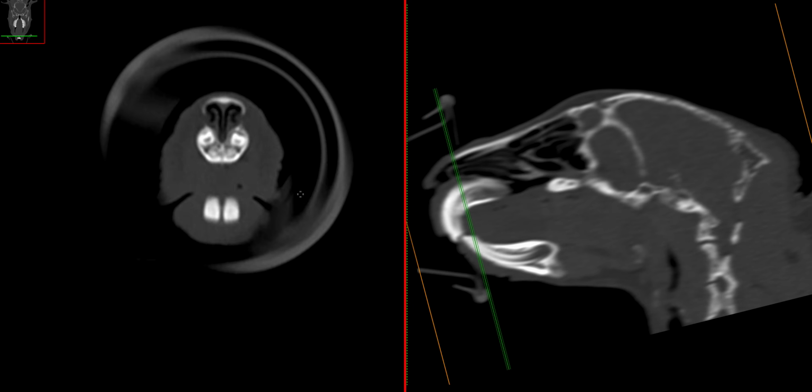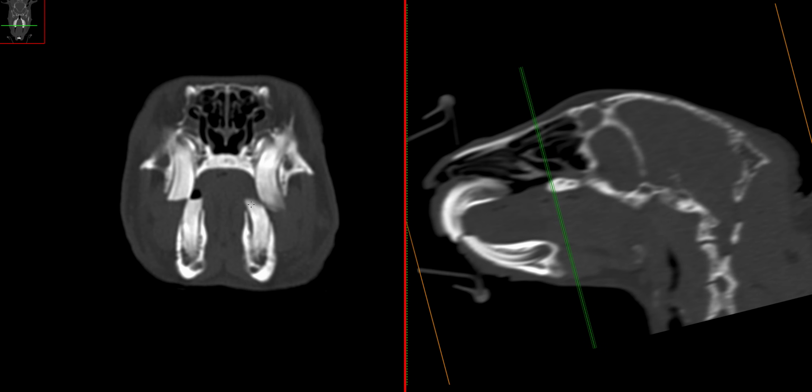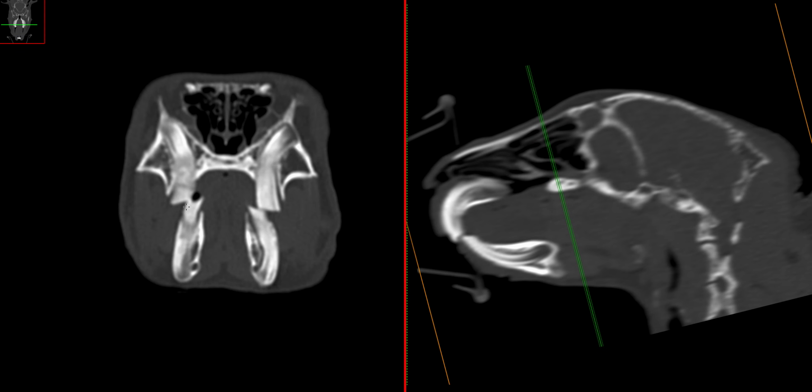So now looking at the mouth, we can actually immediately notice that there are quite a few dental hooks, which are quite sharp actually, and they're at the level of the tongue and at the level of the cheeks. So we have buccal and lingual hooks. So most likely we have a problem with overgrowth of the maxillary and maybe mandibular cheek teeth. But in order to know if this is true or not, we need to check with some measurements.